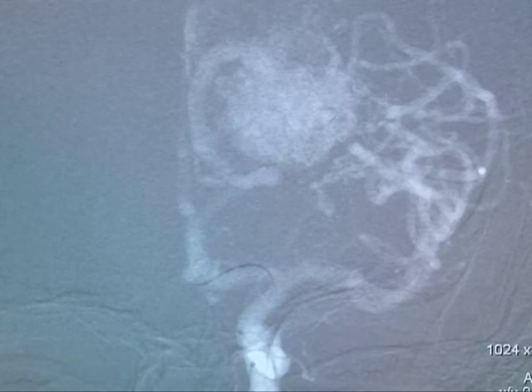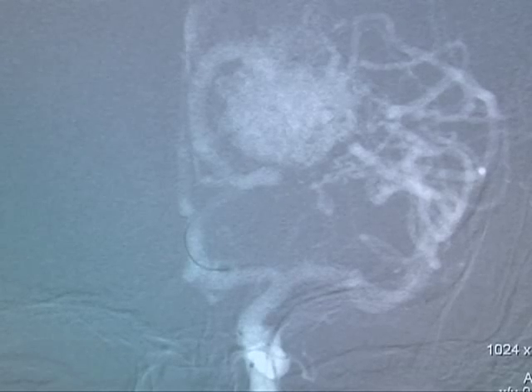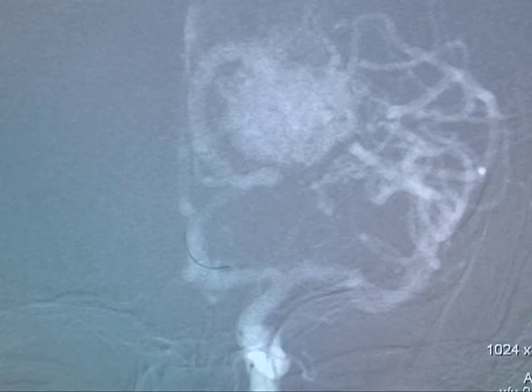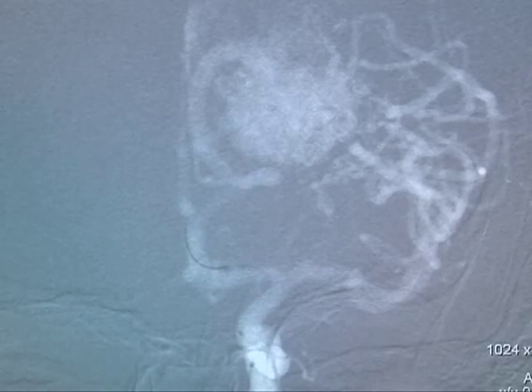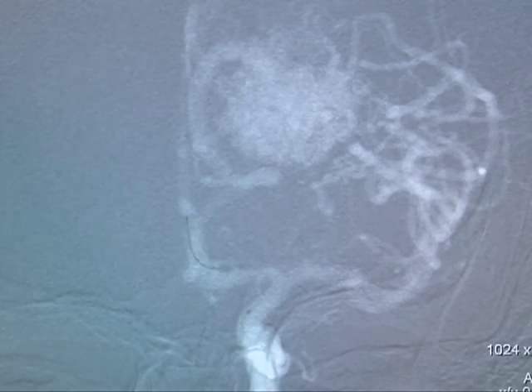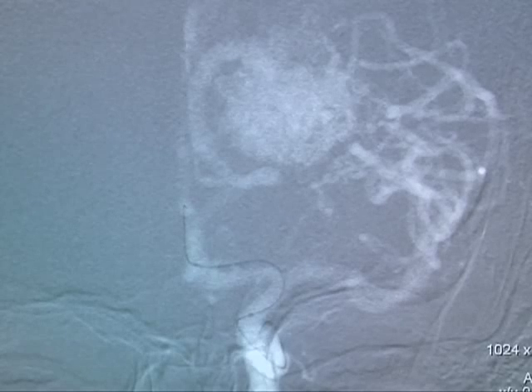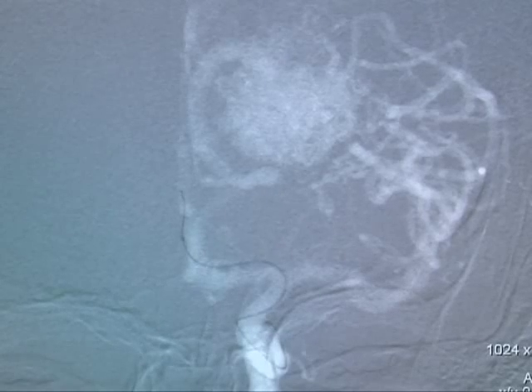At the bottom of the screen, the tip of the catheter can be seen being advanced over the wire. This is a road-mapped view that allows the surgeon to steer the wire and catheter around the various bends in the blood vessels to reach the arteriovenous malformation. The dense cluster of vessels between 12 and 2 o'clock is the AVM, fed primarily by the anterior cerebral artery and its many branches, and partially by the left middle cerebral artery and its branches.